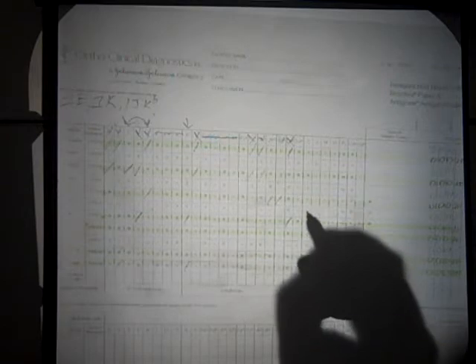Next I have Lewis A. I can use cell line number 1 and cell line number 7 to rule out Lewis A. Lewis B, cell 5 and 8 will rule out Lewis B.